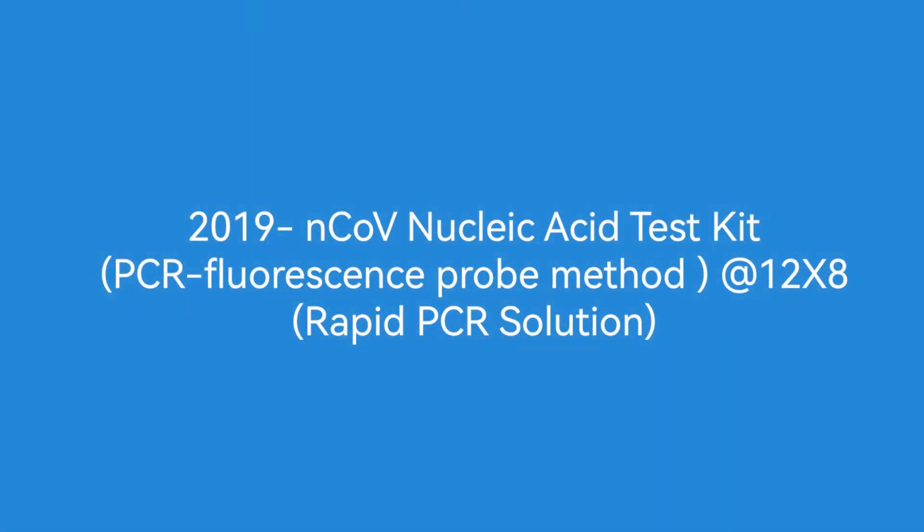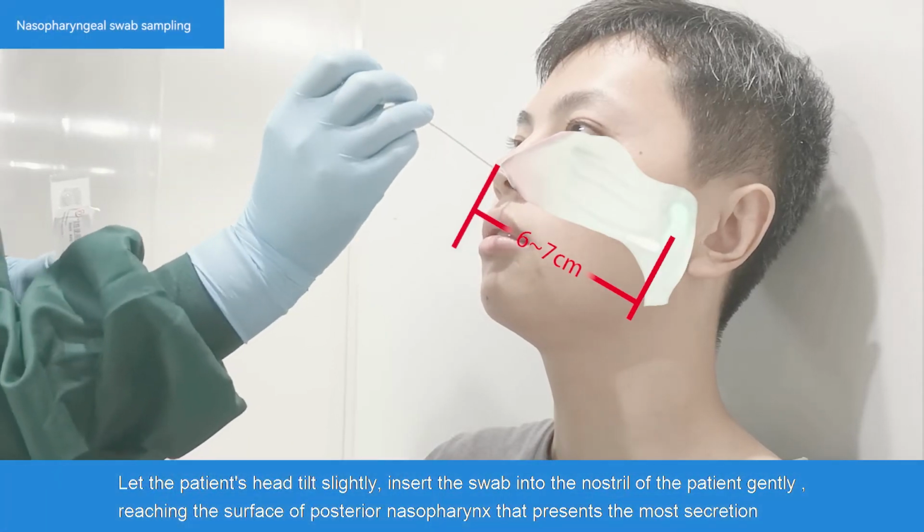COVID-19 Nucleic Acid Test Kit. PCR Fluorescence Probe Method. Let the patient's head tilt slightly.